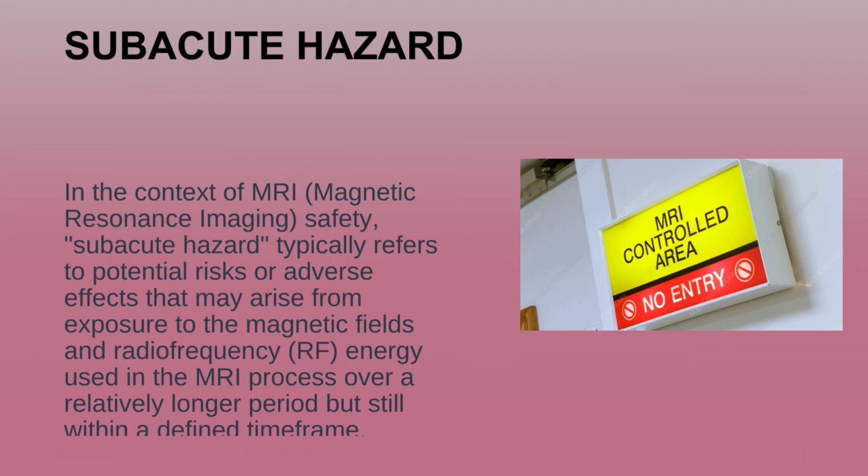Subacute hazard. In the context of MRI safety, subacute hazard typically refers to potential risk or adverse effect that may arise from exposure to the magnetic fields and radio frequency energy used in the MRI process over a relatively longer period but still within a defined time frame.